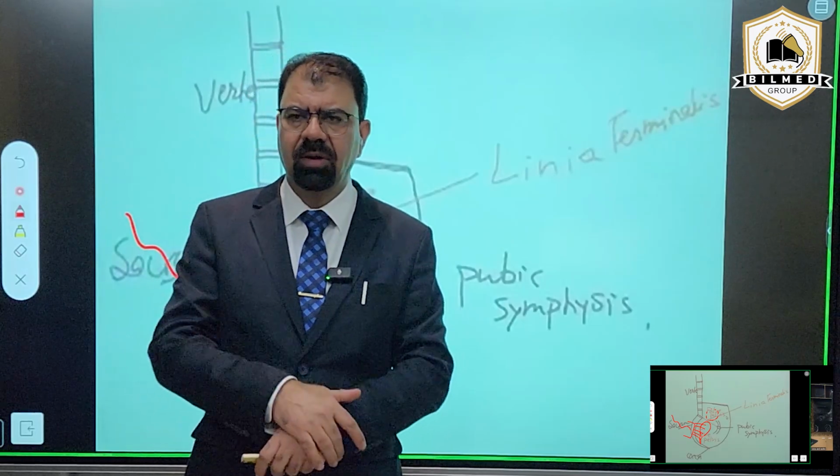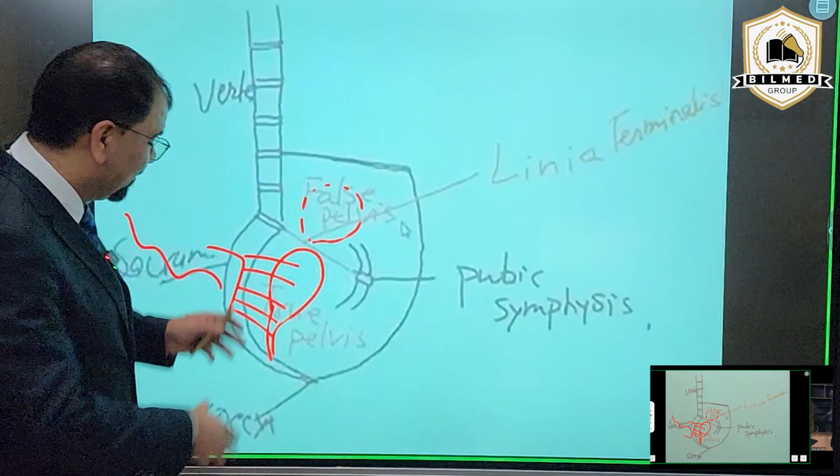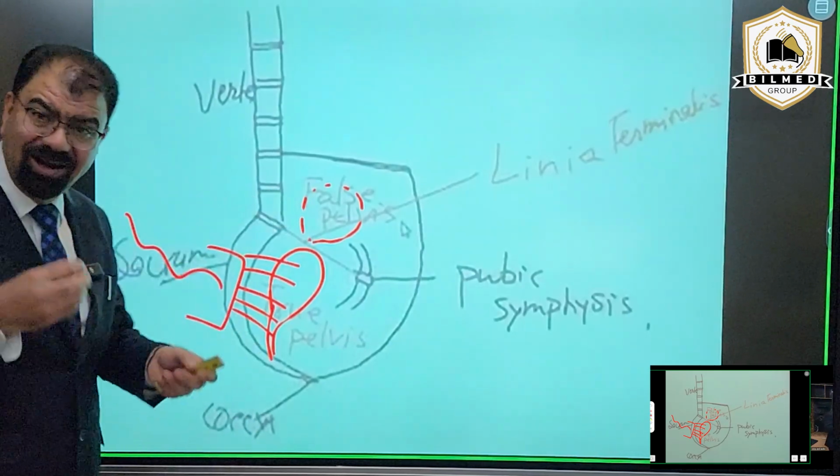Yes, no. No, sir. What does it mean? It means that you are not scanning the false pelvis. You are scanning the uterus only, always.